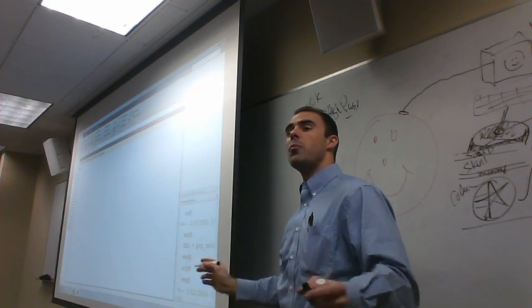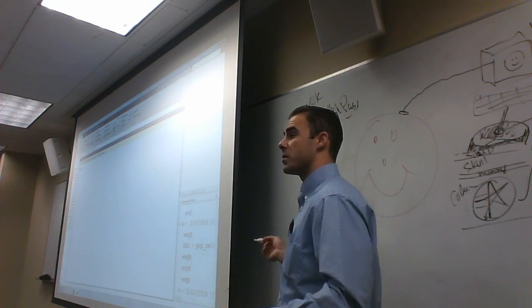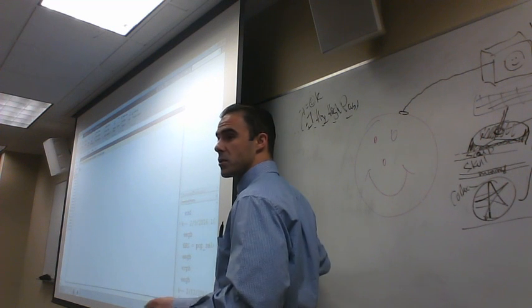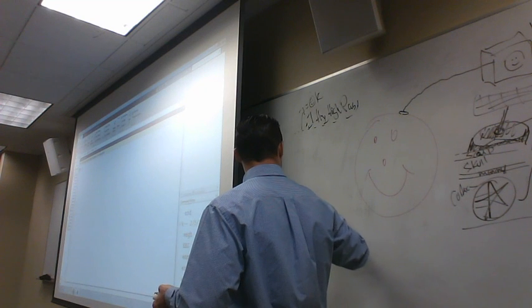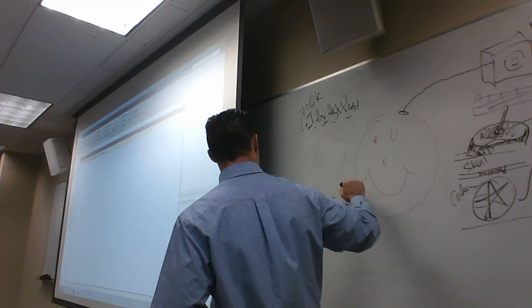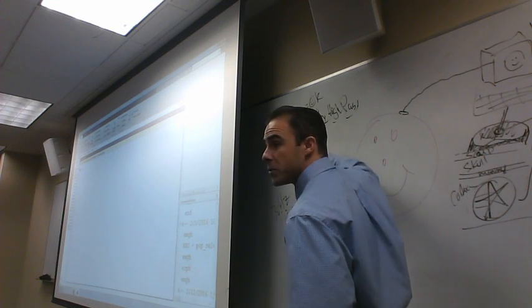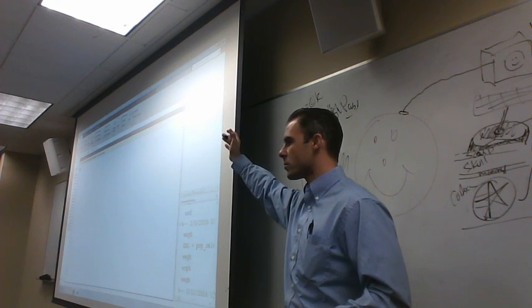Now, when we have a low-pass filter, we'll filter that at, let's say, 30 hertz to get rid of the high-frequency EMG noise. Remember we said we can filter out our EMG? So this is later on in our processing stream, right at the very end, you're going to do, let's say, a 30 hertz low-pass, and the idea is kind of the opposite here. So anything below 30 hertz is going to be okay, which means anything higher than it in our frequency spectrum is just going to be washed out. We're just going to filter that out.